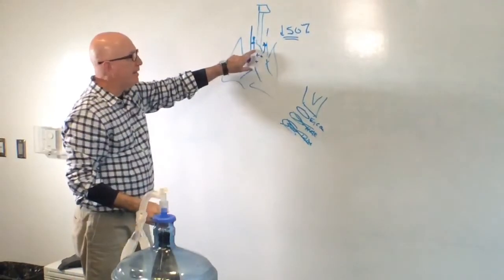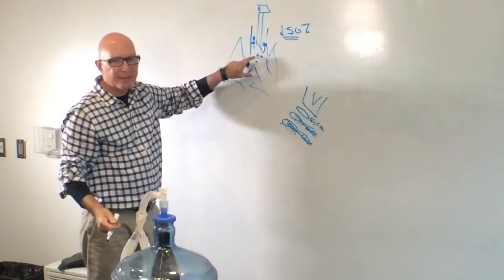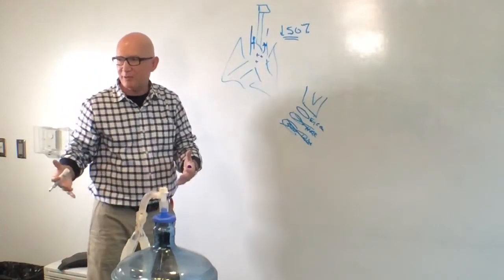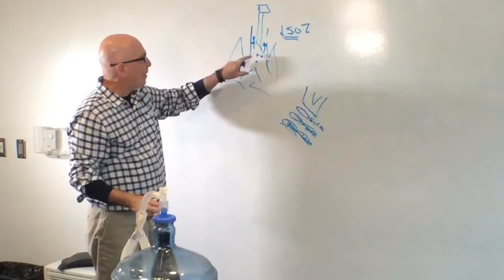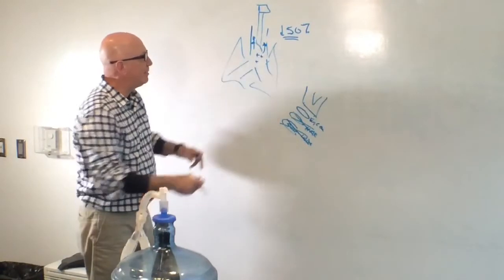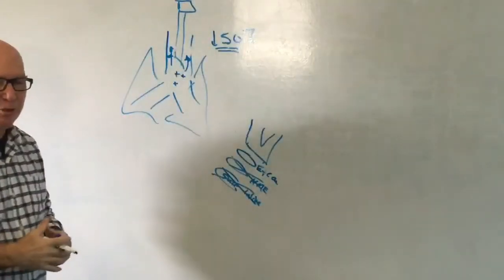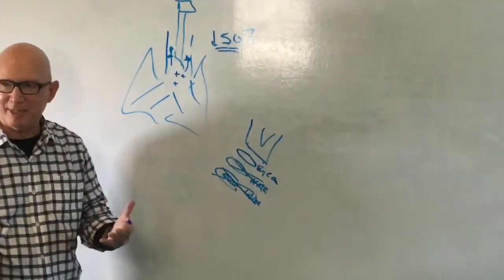So you don't necessarily hear a leak through the whole inspiratory phase, and nor do you necessarily hear a leak during the expiratory phase. As a result, as some of that gas escapes, once you get to expiration, it could be just as if the tube was cuffed, because there may not be a leak.